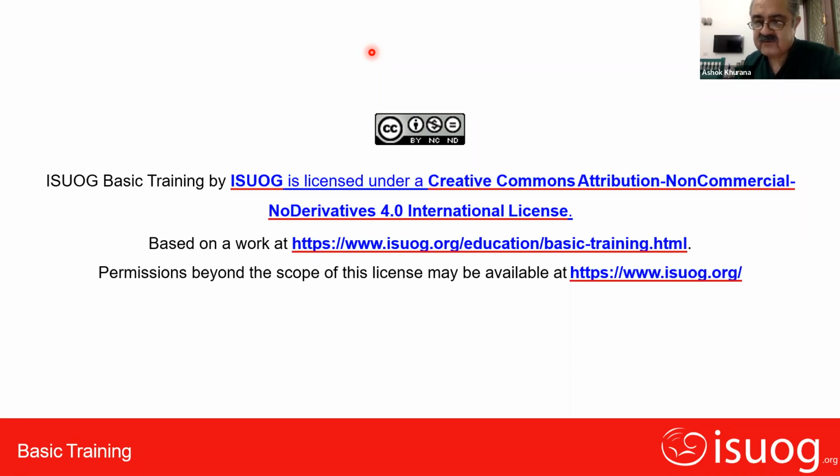But if you have a fistula which communicates, without any degree of esophageal atresia or distal esophageal atresia, then you can miss this completely on an ultrasound scan. That is one of the known pitfalls of an ultrasound scan. You might pick it up in later pregnancy, in the 3rd trimester, because swallowing is never as good. Then you might pick it up as polyhydramnios and a relatively smaller stomach, just as suspicious, definitely not a small stomach.